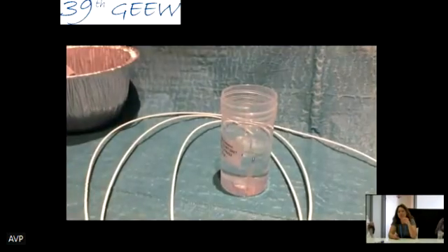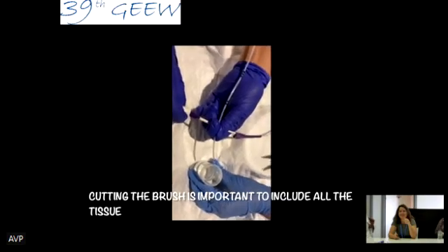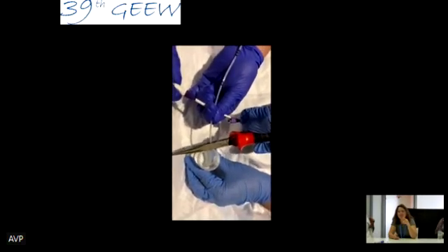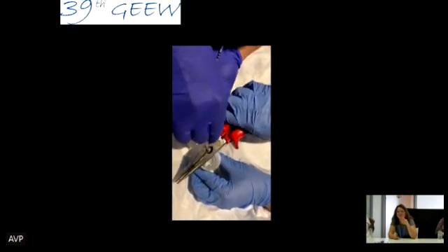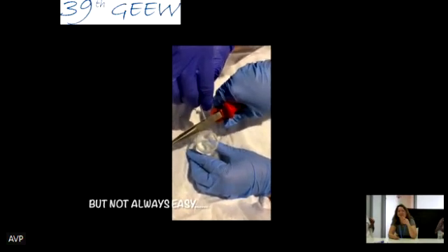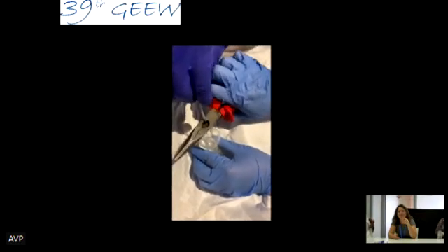You have to have good scissors and buy one of these that cuts well. You'll see this will be more difficult because we made this video some years later, and it's the same device, but it works less well. So we have to buy a new one. It was starting to become a bit tired.